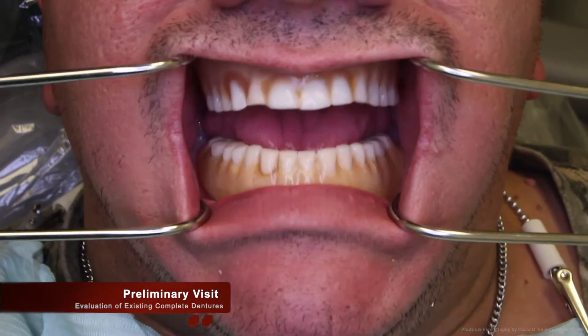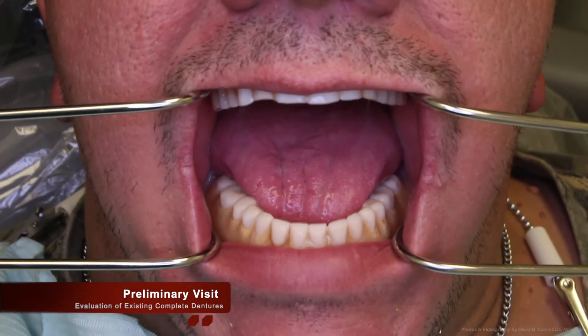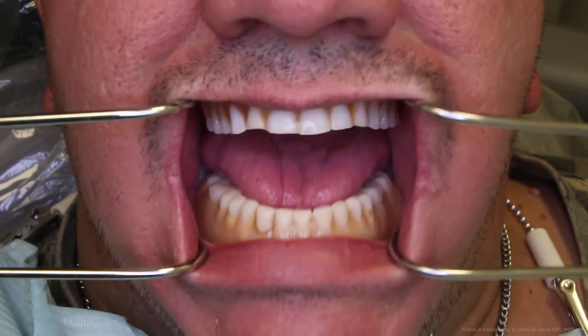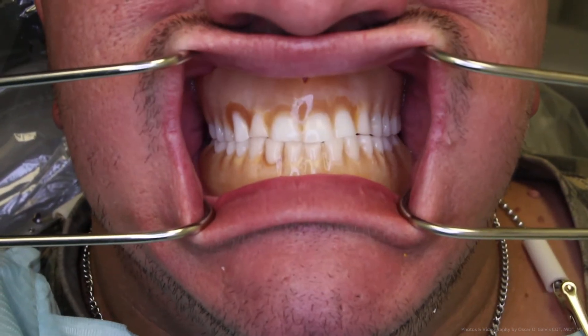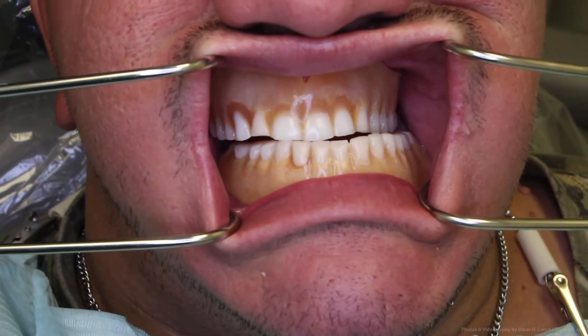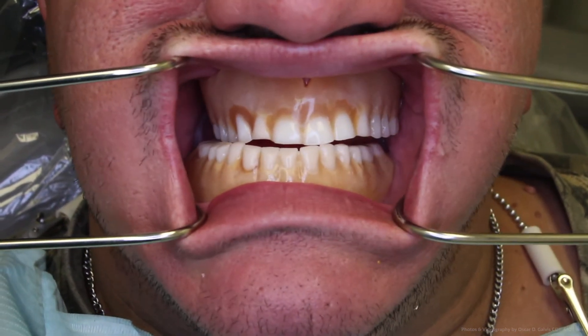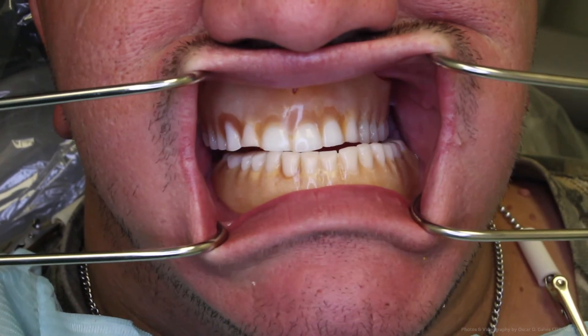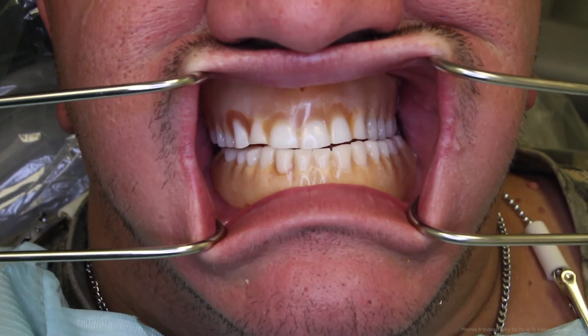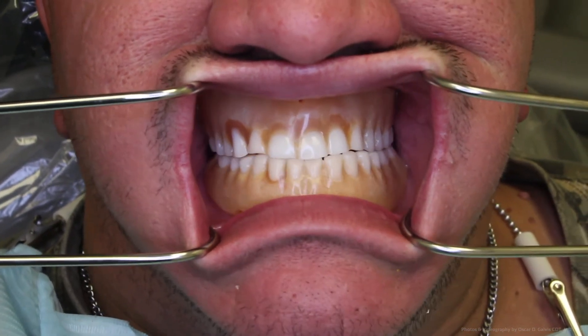In this video, you can see what 10 years of wear does to a pair of traditional acrylic complete dentures. The teeth have worn themselves into one another. This is done through the centric occlusion effect of up and down and the lateral excursions of right to left. His chief complaints are the aesthetics of the denture and the fact that it is loose; however, he says that they are pretty comfortable.